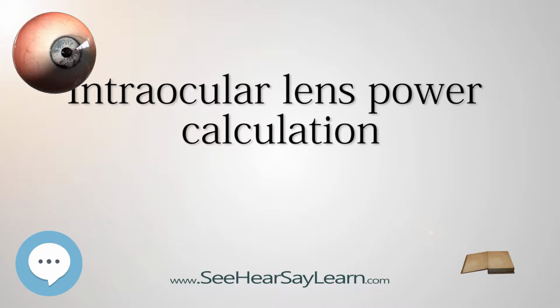The eye is divided ultrasonographically into four components: cornea, anterior chamber, lens thickness, and vitreous cavity. The velocity of sound in these compartments are 1620, 1532, 1641, and 1532 m/s respectively.